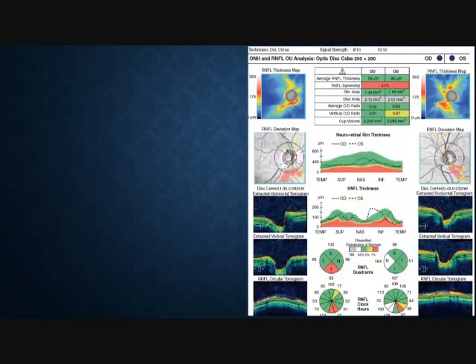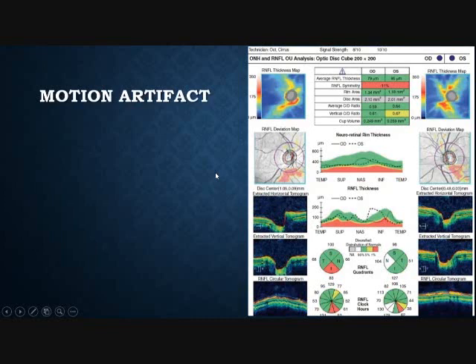What are the findings? Sir, thinning of the retinal nerve fiber layer inferiorly. Okay, one option. Any other explanation? We discussed yesterday, you have to keep in mind the artifacts. This is the line. This is the motion. The left hand motion artifact. Again, a line here. So this is a motion artifact. So look always carefully at the figure and see if there are motion artifacts. Do not rely on these findings.